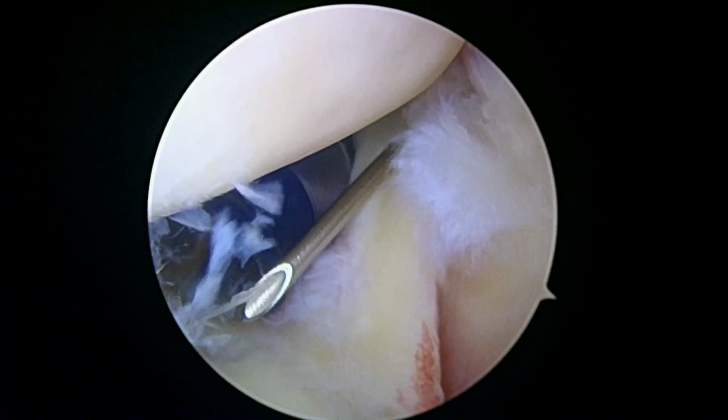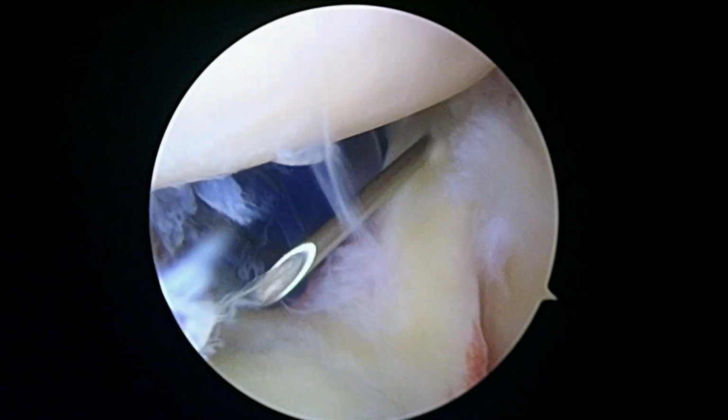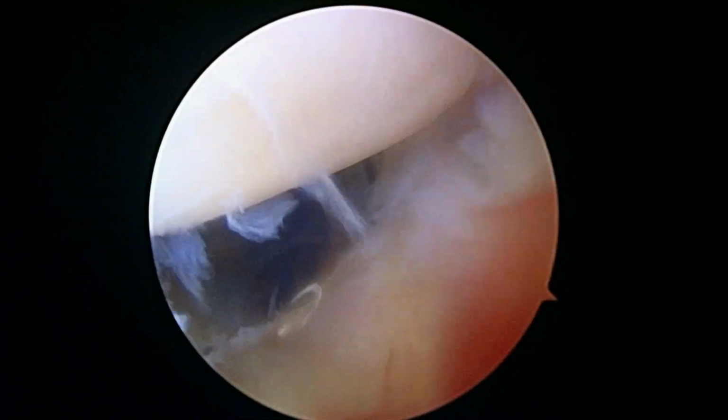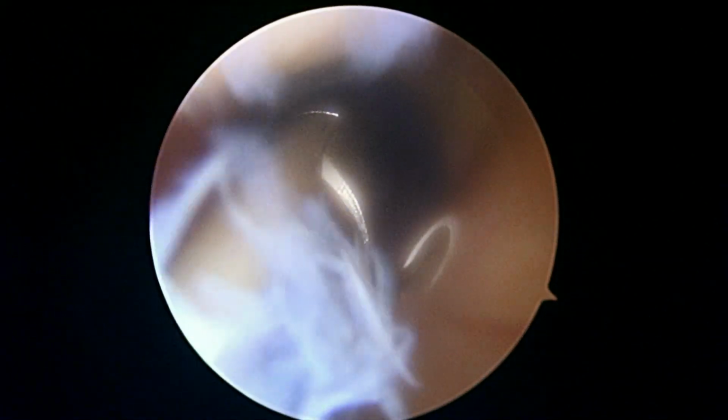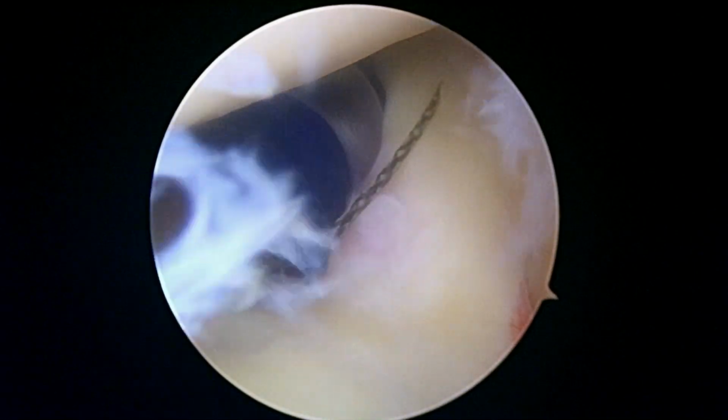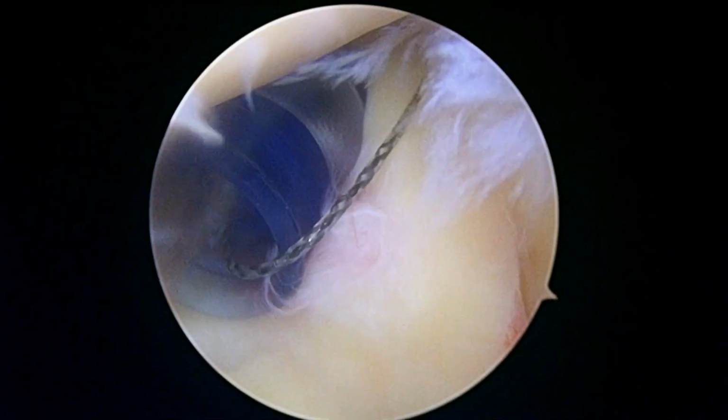Hold the camera here, two hands. And then we'll take a grasper. And this is because we're going to be doing what we call a biceps tenodesis, which just means we're going to be securing the biceps. Careful of something. Okay. It means we're going to be securing the biceps in a different part of the shoulder. We'll get to work here and show you some more in a little bit.